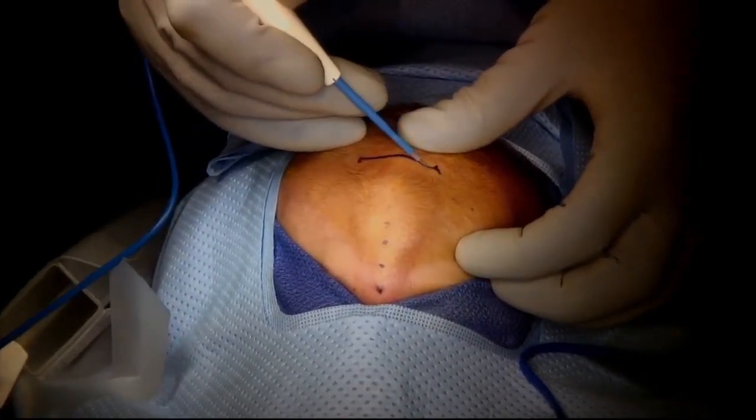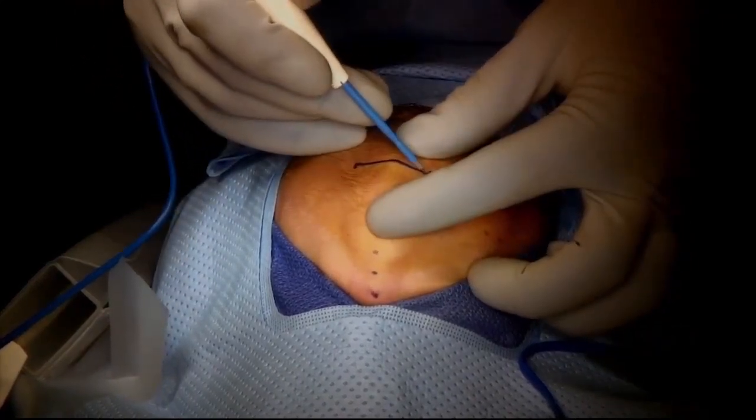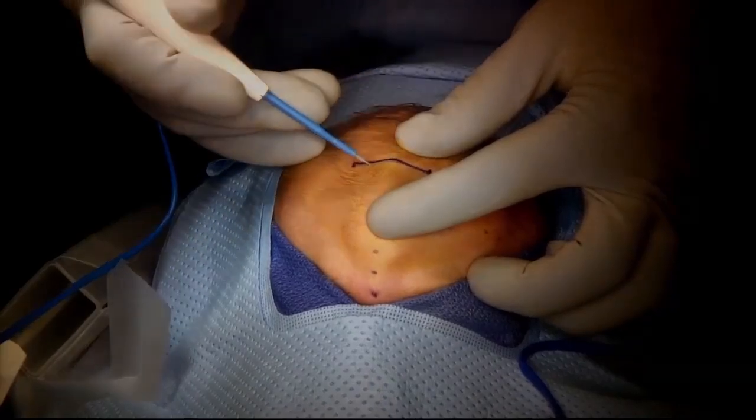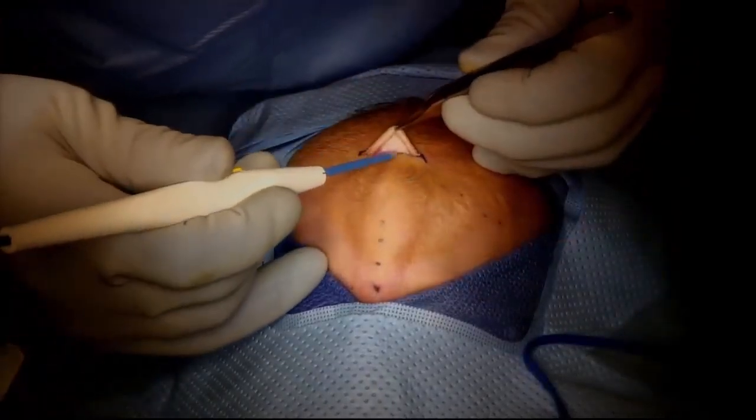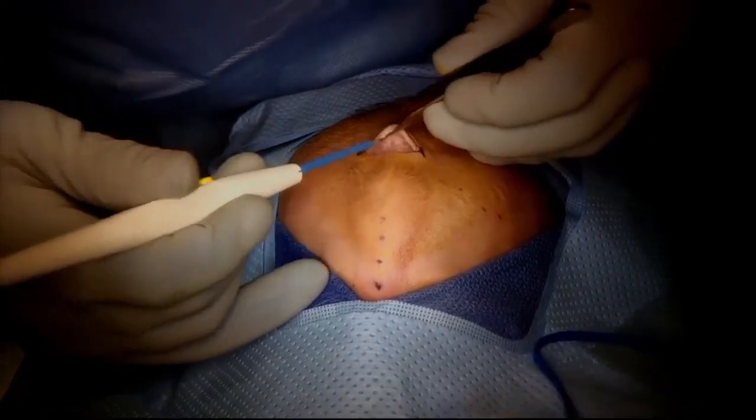The patient is placed supine on a cerebellar horseshoe head holder. A bloodless incision is made behind the hairline with a needle tip Bovie. Subgaleal dissection is begun towards the anterior fontanelle.